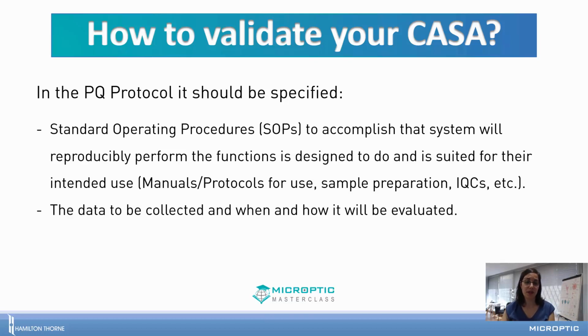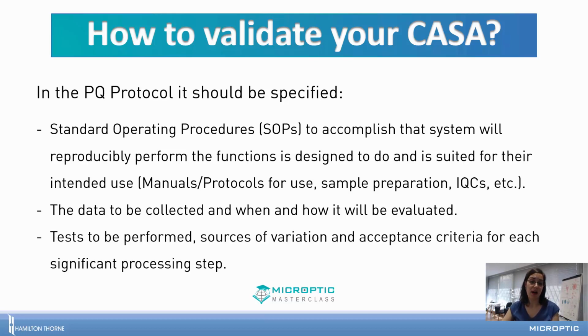Also, it's important to define how the data is to be collected and how it will be evaluated, and the tests to be performed, specifically defining the possible sources of variation that you can find in each step, and what the acceptance or rejection criteria are for each step.